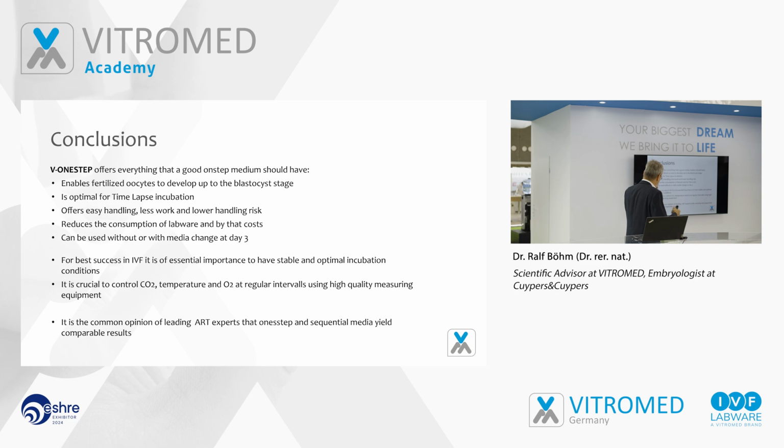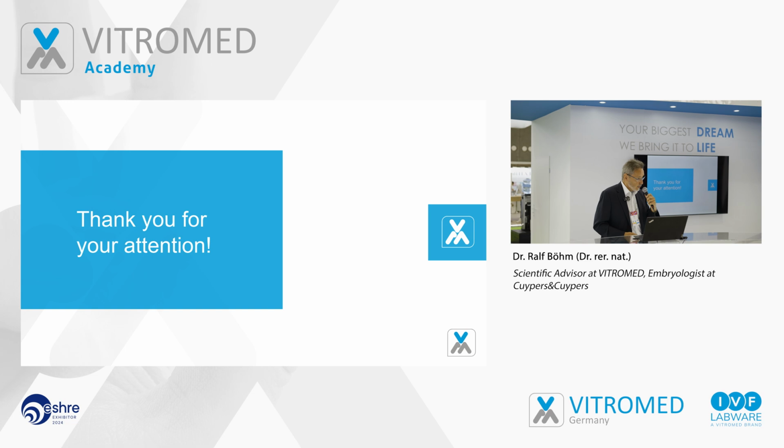And to come back, for best success in IVF, it is essentially important to have stable and optimal incubation conditions. And it is crucial to control CO2, temperature and O2 at regular intervals using high quality measuring equipment. And like I showed in this Delphi paper, it is the common opinion of leading ART experts that one-step and sequential media yield comparable results. Right. Okay, thank you for your attention.